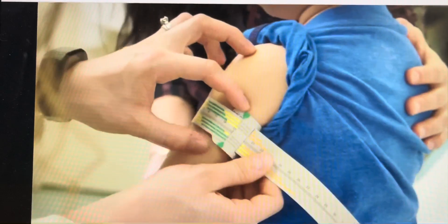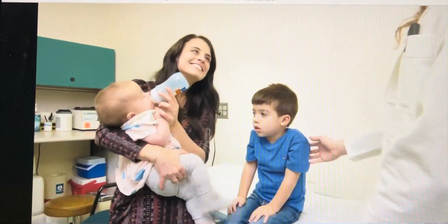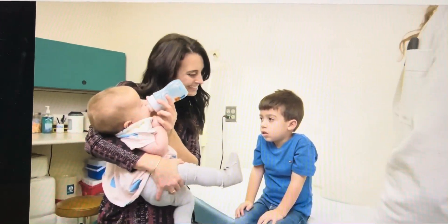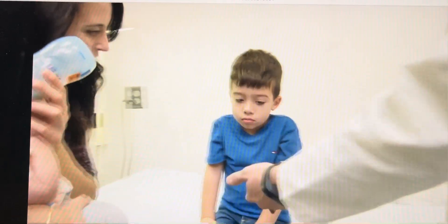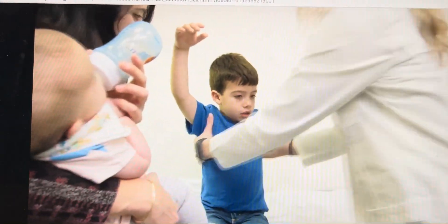For future measurements, always use the same arm. Mid-Upper Arm Circumference measurement and the corresponding Z-score can help you identify children at risk for nutrition or growth issues and can help determine if appropriate nutrition intervention is needed for your patients.